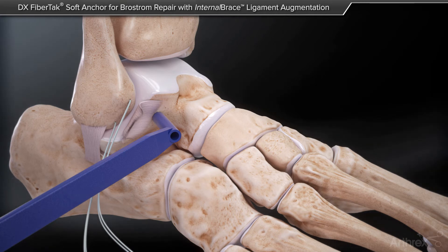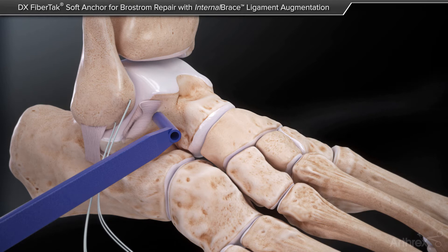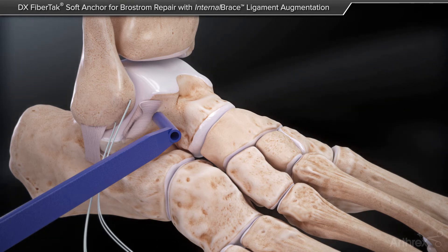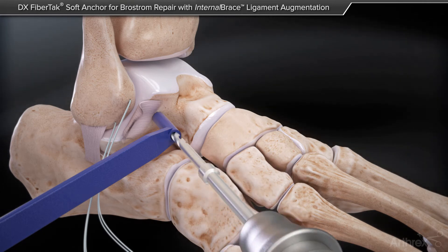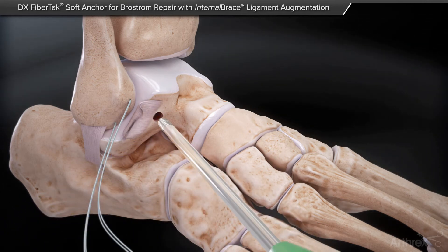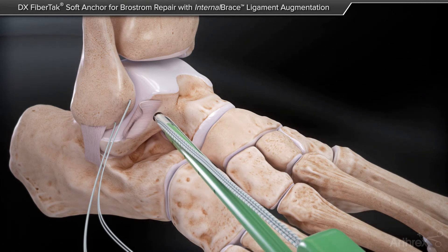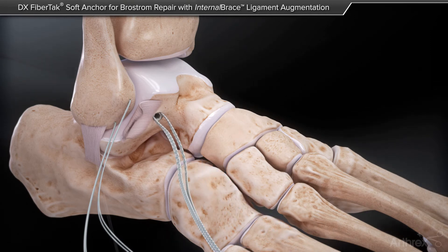After this, we will proceed to place our internal brace. The internal brace I like to compare as a seat belt that allows motion but prevents motion beyond a certain physiological point. This allows for faster rehabilitation after surgery. Here you can see the drill and tap for the internal brace, which is then affixed.